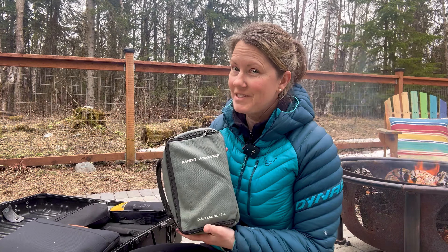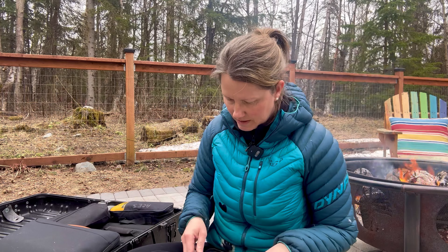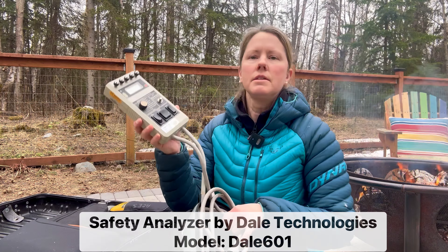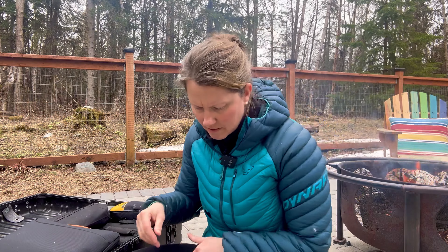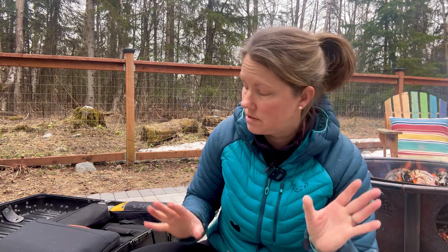I've got my safety analyzer — this is an important one that I carry with me. I use it for testing the grounding on different types of equipment, from EKGs to just about anything really.